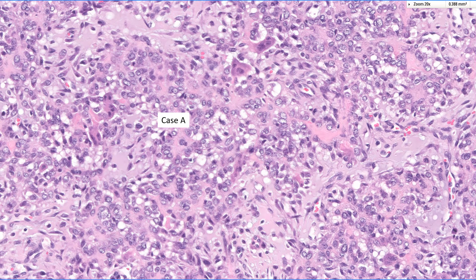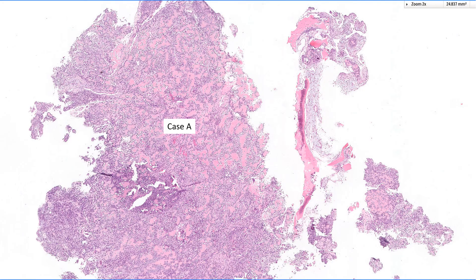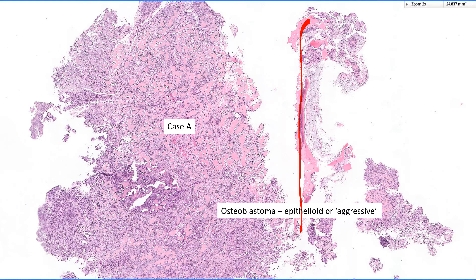There are epithelioid areas, but you can see bone again lined by osteoblasts. Most importantly: there is no infiltration of pre-existing bone, and there is a shell of encasing reactive bone around the lesion — that certainly helps. In the old days this would have been called an aggressive osteoblastoma; today we'd call it an osteoblastoma with epithelioid features.